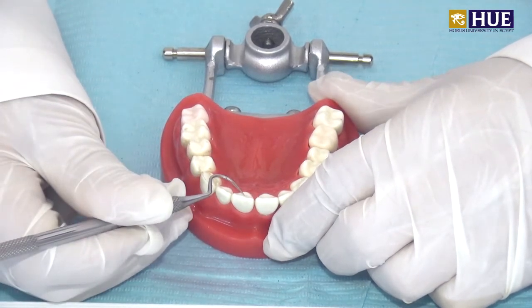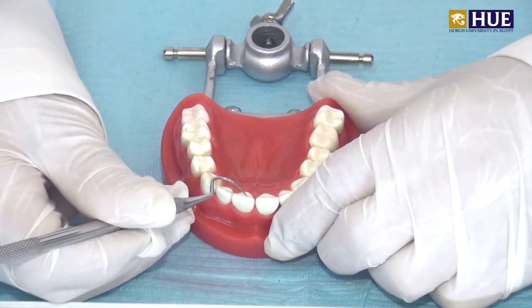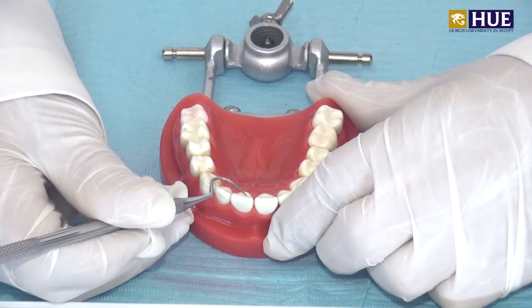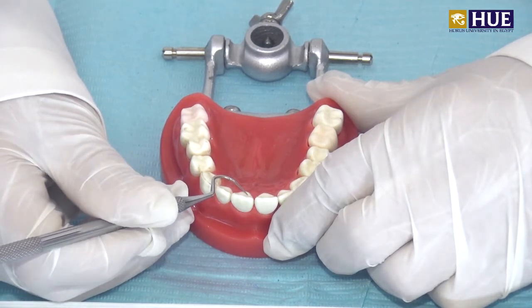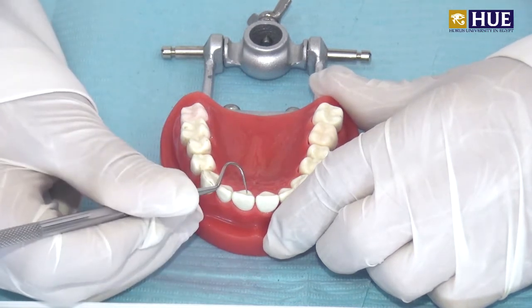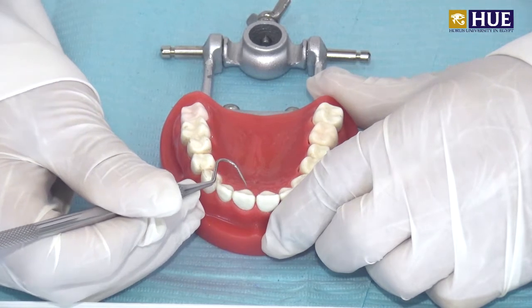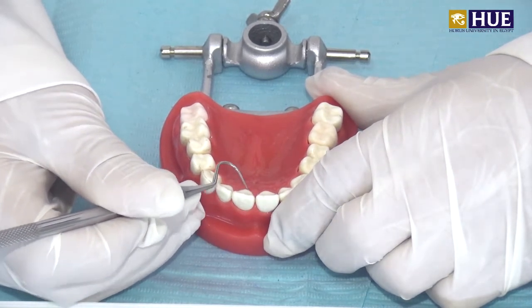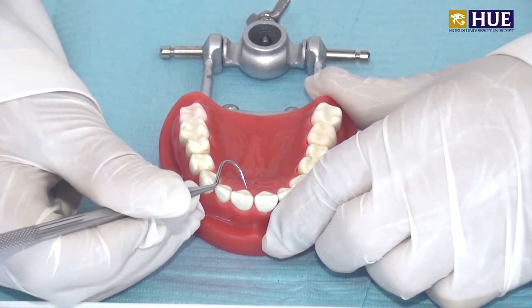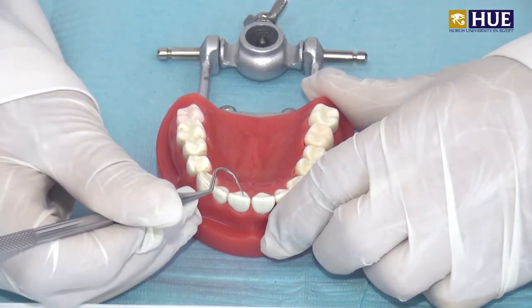The third design of conventional GV Black is a conventional root design, where all cavity margins are on the root surfaces. Today we will show you demonstrations of the conventional and bevel designs of type 1, in which all margins are within the enamel.